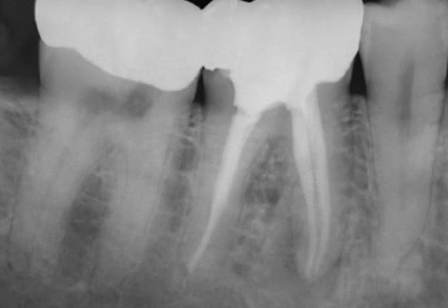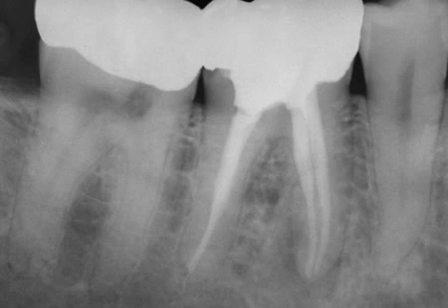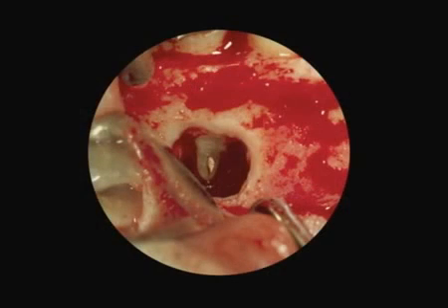It is only fair to mention that not all perforated cases can be managed successfully non-surgically. This case was handled surgically. The problem wasn't obvious on the preoperative radiographs, but with the flap elevated, you can see the gutta percha leaving the root on the lateral aspect.